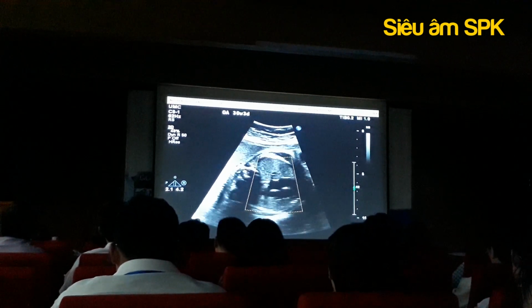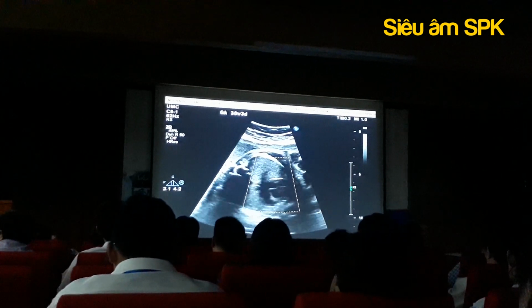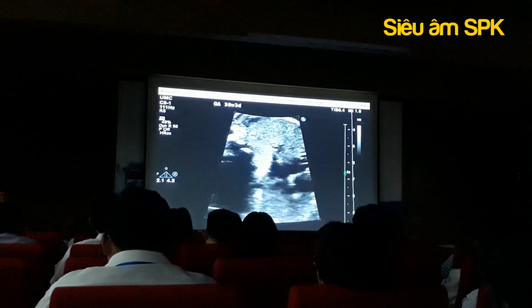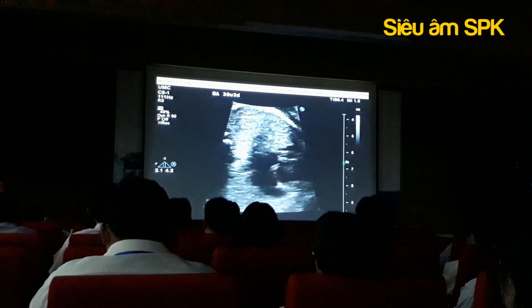So what have we seen so far? We've seen the systemic venous anatomy, atria, AV connections. We haven't seen pulmonary venous connections, and so we might want to do that. We're in a good angle to look at pulmonary veins.